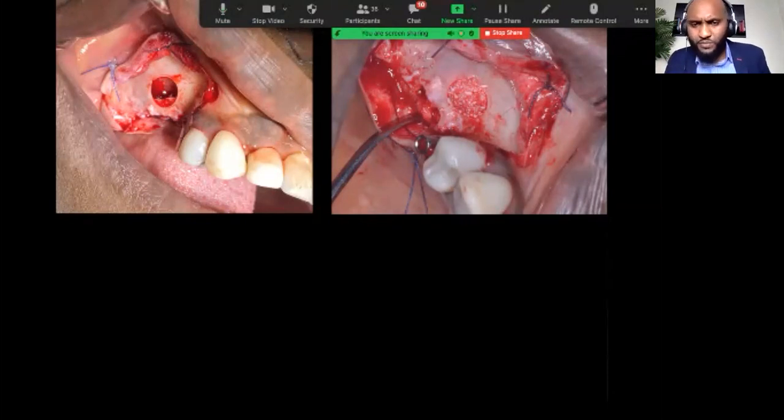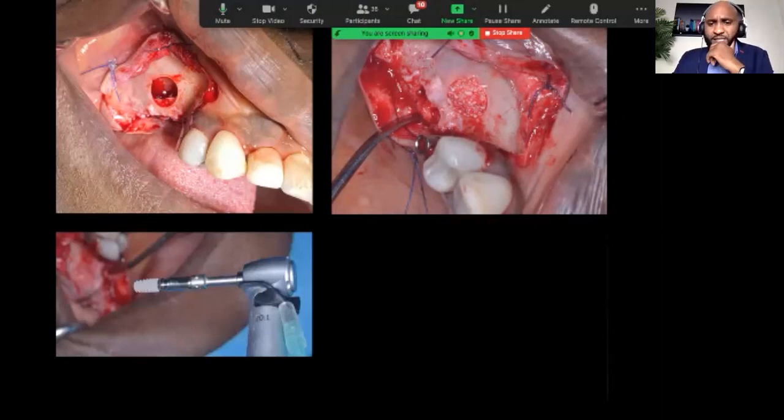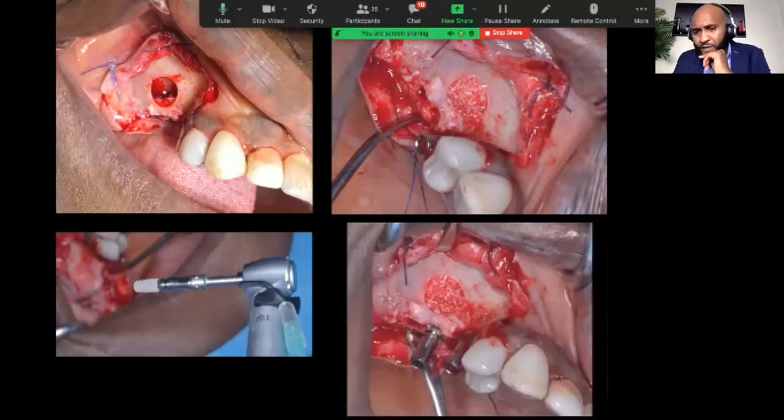So what bone material will I use in this case? I could use a patient's own bone, but it will resorb in a very short time. I doubt I'll have regenerated the amount of bone I need, and you've seen how much defect we have. So in this case, we chose an appropriate bone material, which I'll show you. Then we use the short implant as indicated. Then the 2 implants in place and the graft material exactly where we would want it to be.